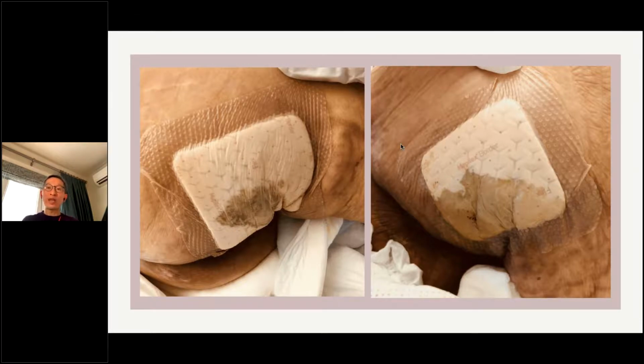Just before we changed the dressing, on your right-hand side, in this picture here, you can see now the stain is growing bigger, there's more fluid, and still the fluid is not leaking out from the dressing itself. And there's no evidence that the dressing is drenched and soaked with urine or contaminated with fecal material. So I think this is a good case to show you that the dressing itself, because of its flexibility and conformability, is able to create a very localized, sealed environment to lock the exudate in the dressing itself and prevent external contamination like urine and stool from getting into the wound.